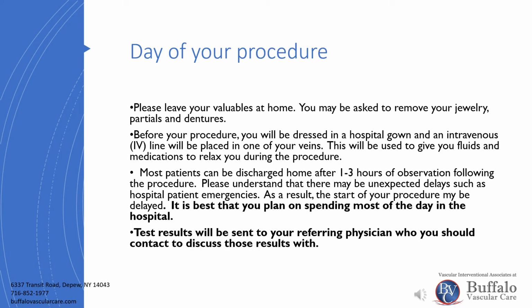Before your procedure, you will be dressed in a hospital gown and an IV line will be placed into one of your veins. This will be used to give you fluids and medications to relax you during the procedure. Most patients can be discharged home after 1 to 3 hours of observation following the procedure.